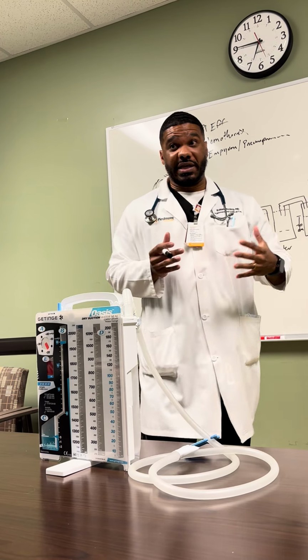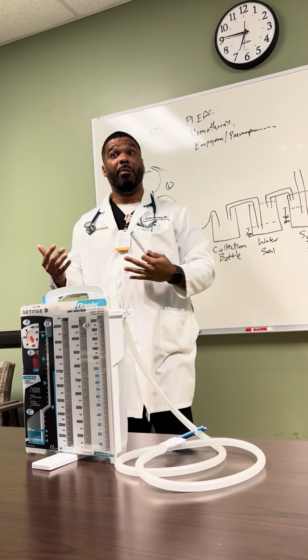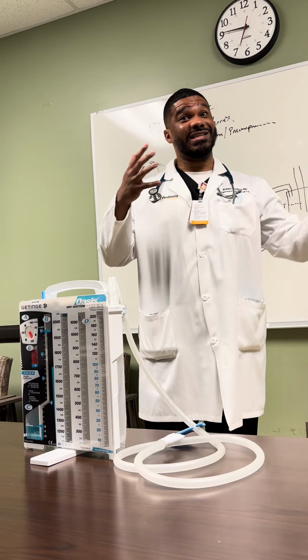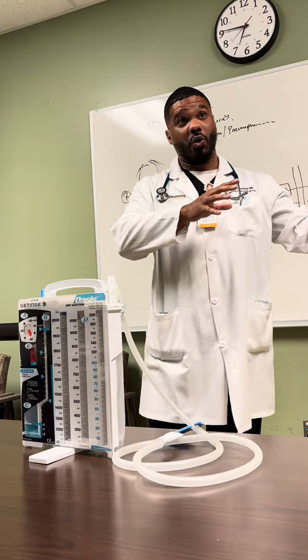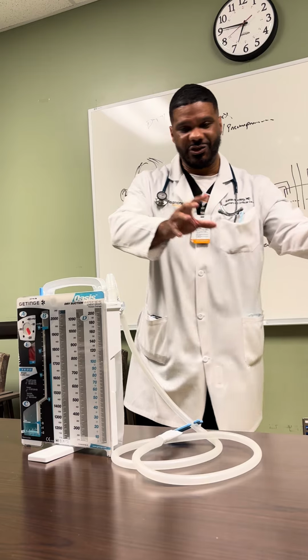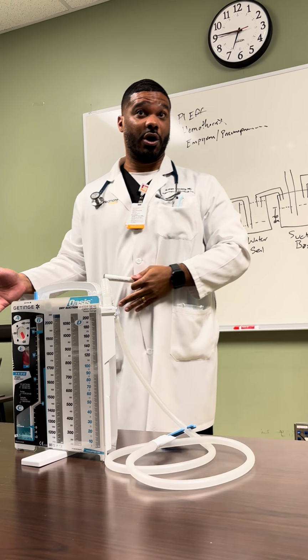So basically from a nursing standpoint, what we should be doing on a daily basis is number one, going into the room and assessing the patient, okay? And basically just to keep your thoughts organized, you assess your patient and you just kind of trace everything back to the atrium and make sure that there's no issues along the way.